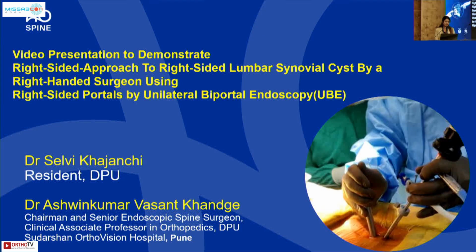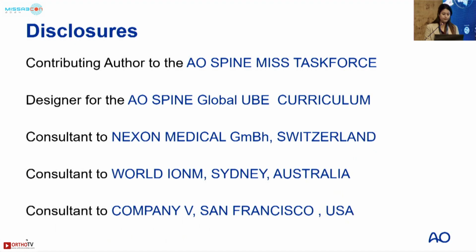My topic for today's presentation is a video presentation to demonstrate a right-sided approach to a right-sided lumbar synovial cyst by a right-handed surgeon using right-sided portals by UBE. The case is done by Dr. Ashwin Kumar Khange. These are his disclosures.